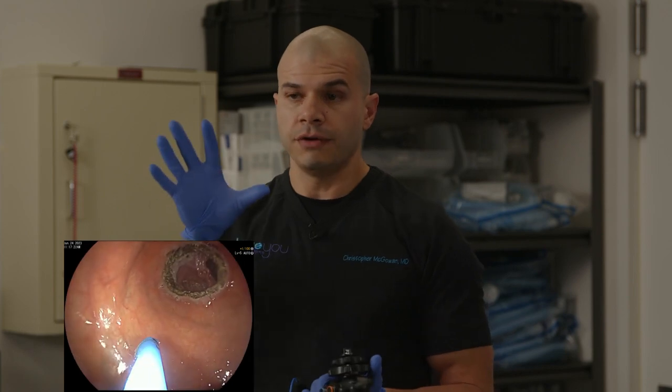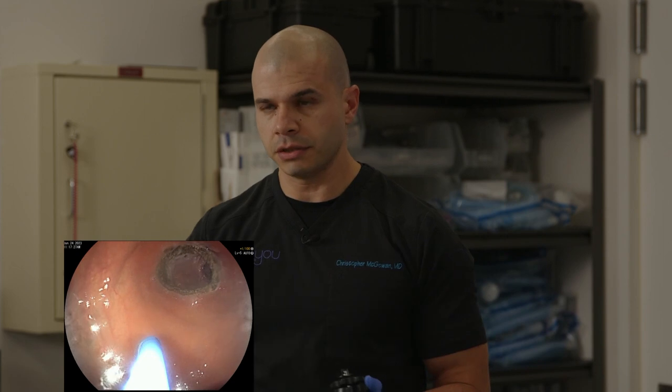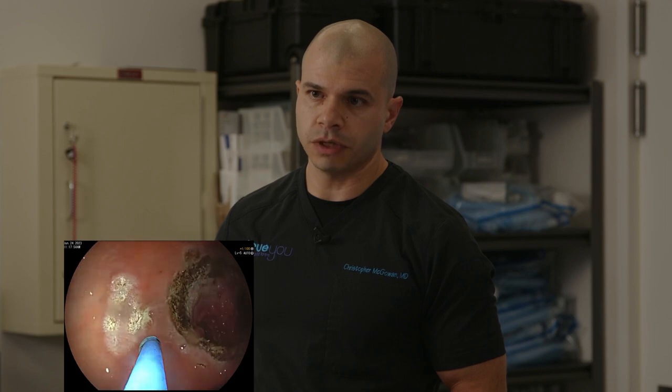All right, so now I'm going to ablate. This is our technique at our center here in Cary and with Dr. Maselli in Atlanta. We prefer to ablate the gastric pouch mucosa prior to suturing that as well. So we're going to do an outlet revision and a gastroplasty of the pouch. This is still somewhat in the investigational stages, but ablating the mucosa of the pouch will allow it to remodel and heal and tighten down along with the suturing that we'll do, which really creates a very snug and durable reduction in the pouch size as well.